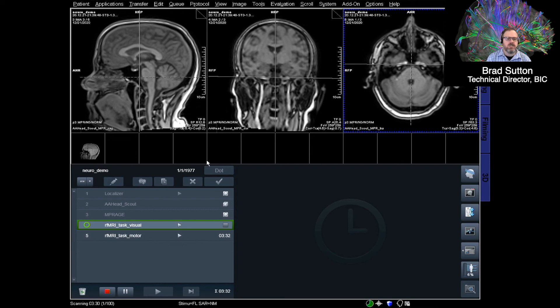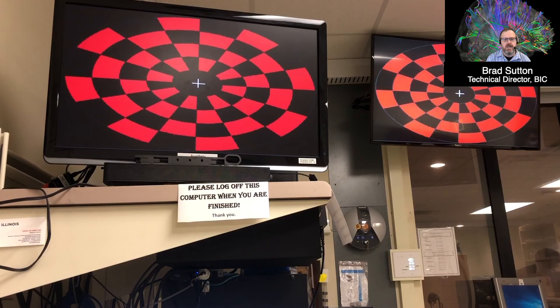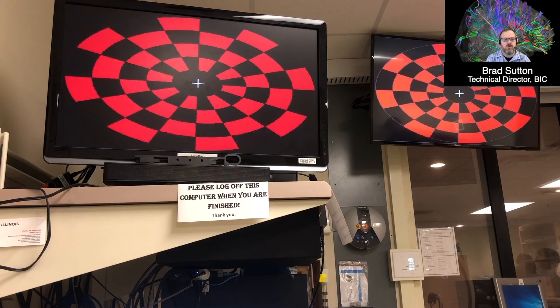When the scan is running, you'll hear it sounds quite different from the structural scan — much more choppy — but it's acquiring images really quickly. These are low-resolution images without a lot of contrast, but the goal is to get a time series of brain images to watch where the signal goes up when the flashing checkerboard is on. The subject in the scanner sees this display through a mirror mounted in the coil and keeps their eyes on the white plus sign — the fixation cross — in the center.